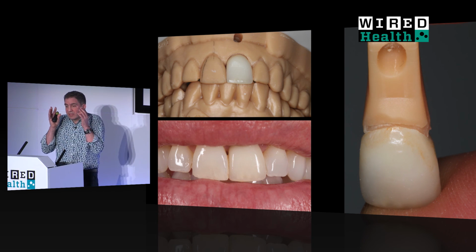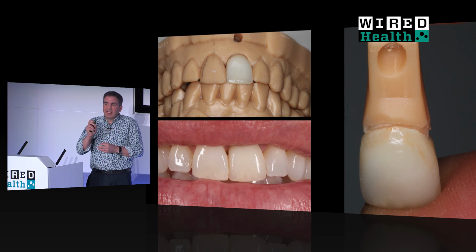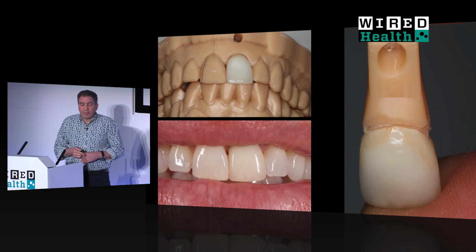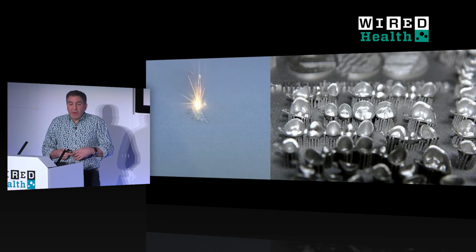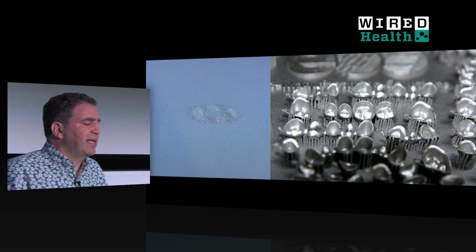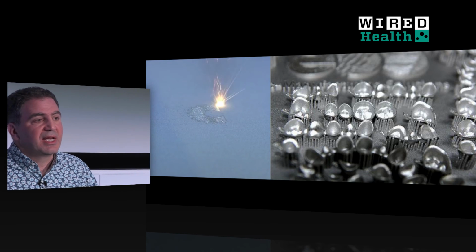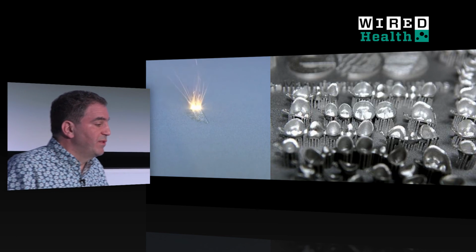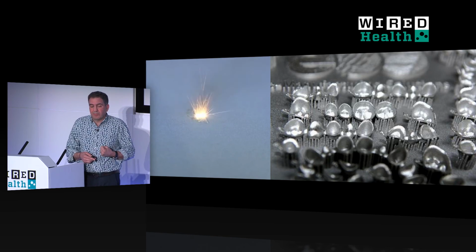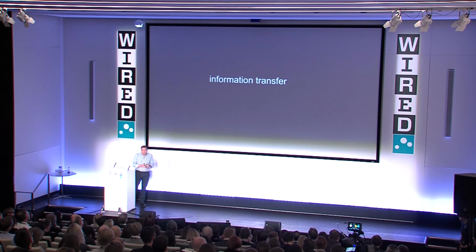Now we can concern ourselves with the detailed aesthetics on the surface of what we make in this context. And when we make things in metal, we're fusing powders together, and we can make things in large varieties of metals, biocompatible metals like titanium, metals that we can fuse porcelain to like cobalt chrome. So we can make a lot of things with 3D printing, and we do.